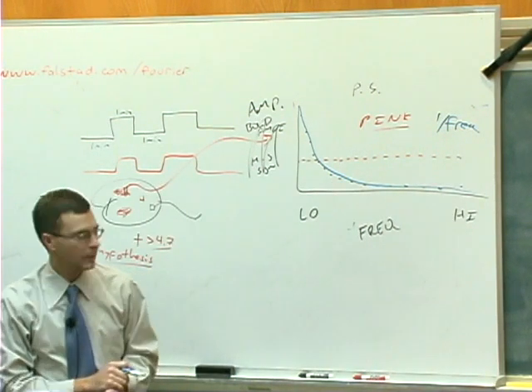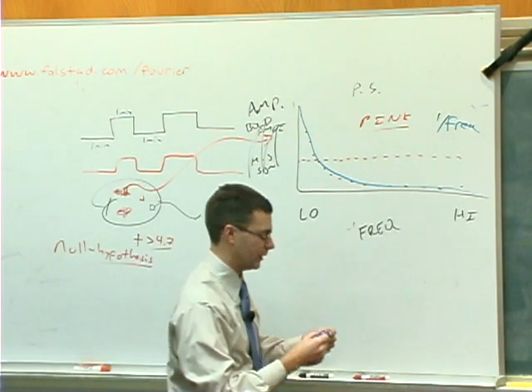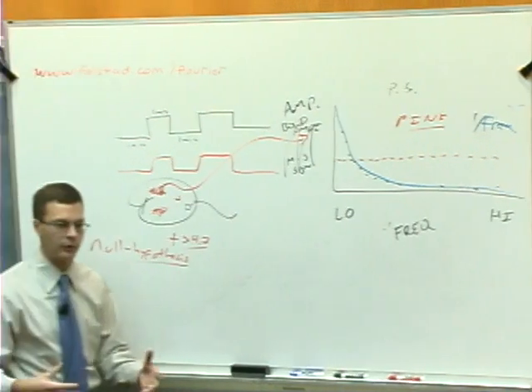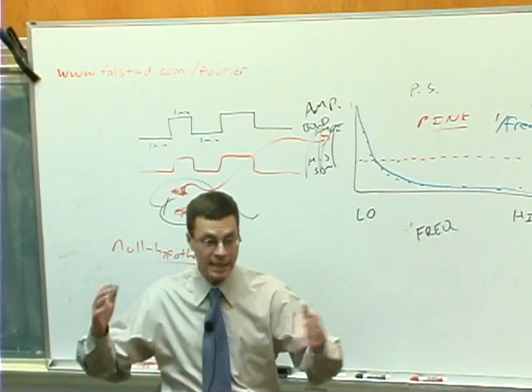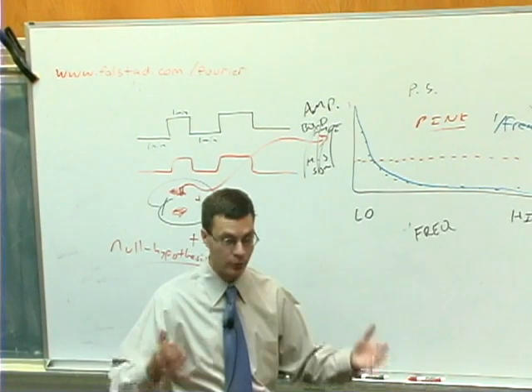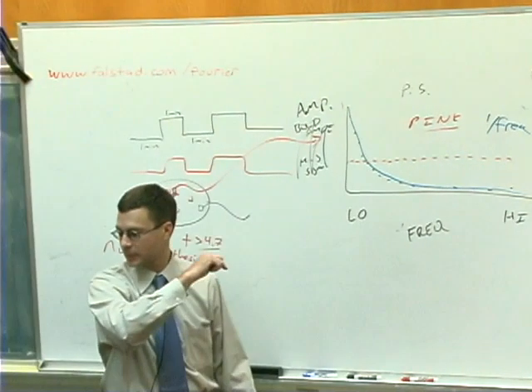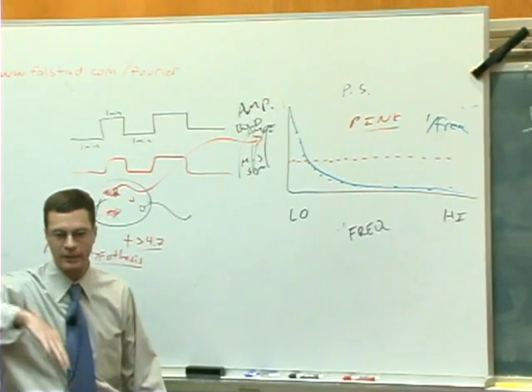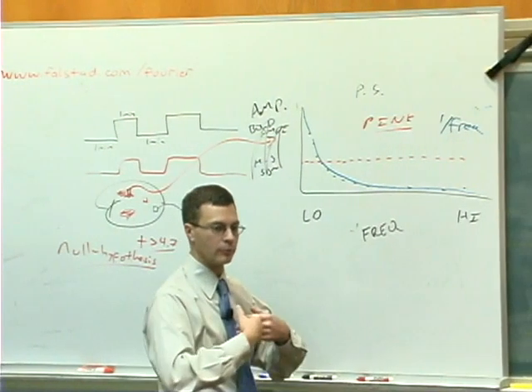So what's this doing? The property of having noise like this is that if you create an experiment looking for low frequency, slow changes in neuronal activity in your BOLD fMRI signal, you're going to find it. Even if the graduate student doesn't turn on the stimuli, you're going to find slow changes in signal rising and falling within the BOLD fMRI data, just all on its own, with someone resting quietly in the scanner. Oh, it's always the graduate student's fault.